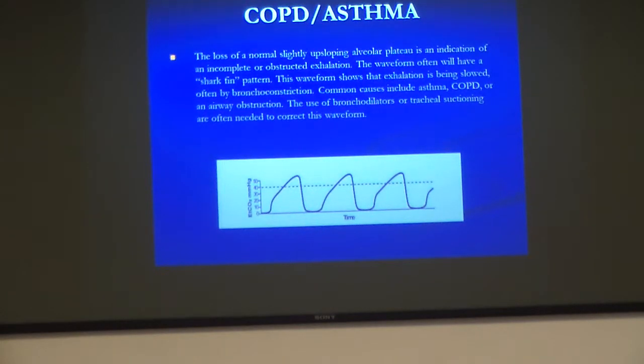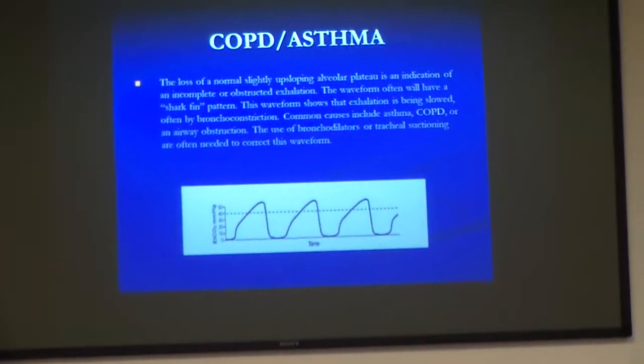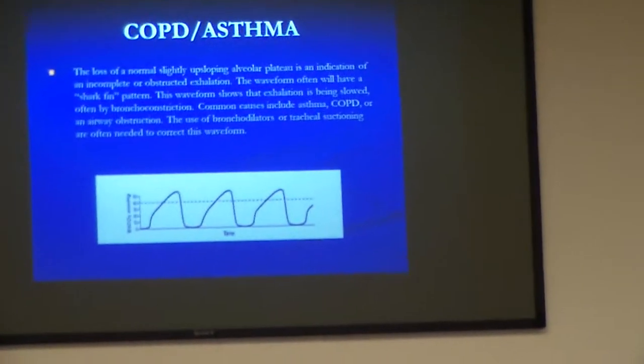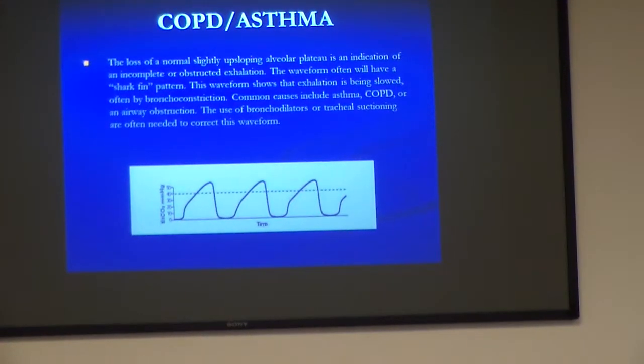Sometimes when you start going through different waveforms, you start getting a little stressed, I know myself anyway, like, okay, what does each thing mean? Am I gonna remember this at the moment? Go back to your assessment, because that's the most important thing. But this is a tool for you to use.